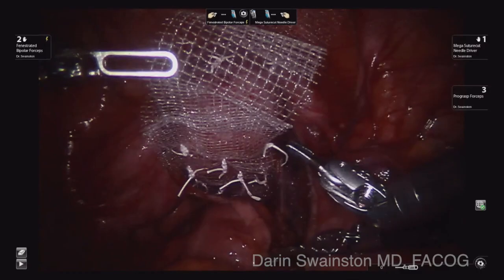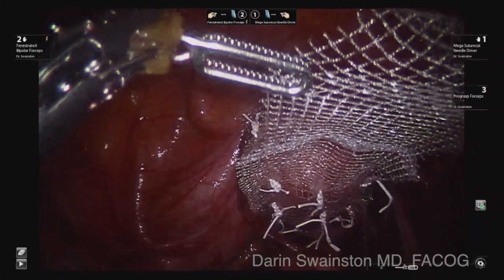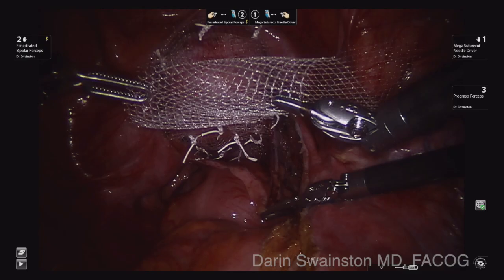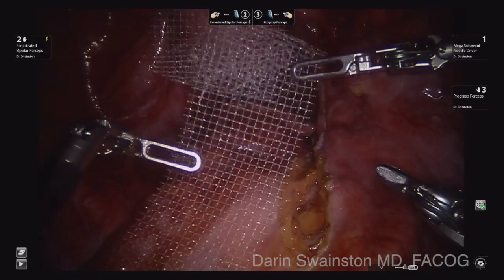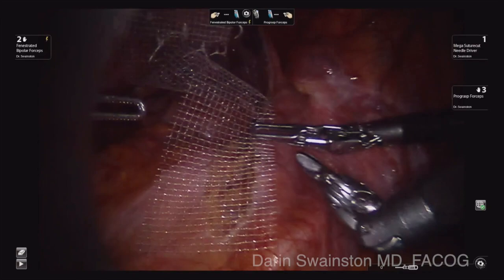I have placed everything in there. I am going to now check: do I like what I have here? I do. It is equal pressure, maybe a little bit more posterior than anterior, which is what I want. This is the crucial part of sacrocolpopexy. I want to pull that straight, then use one hand placed against the sacrum to hold it in place.